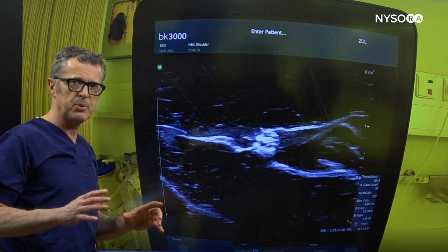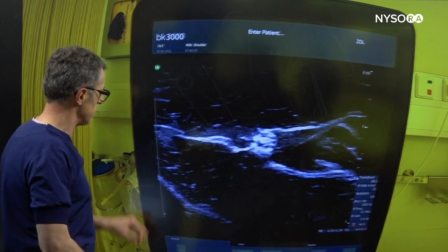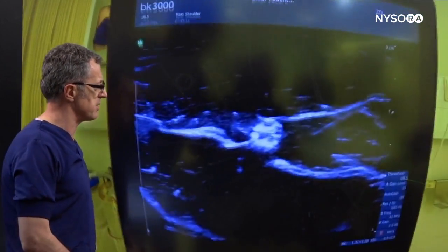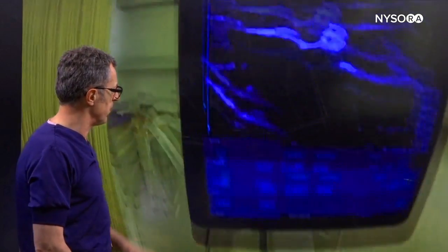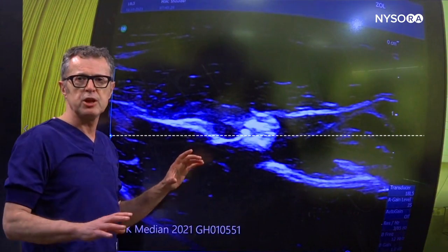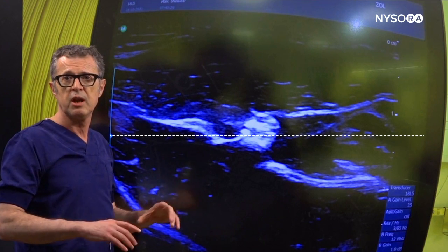What's still left to improve is to see whether adjusting the focal point gives us even more granularity or resolution. The focal point is currently below the level of our interest. Going to the controls of the machine, we find the button for the focal point and use the trackball to raise it up to the level of the nerve. That's about the best we can do for this purpose. These adjustments take literally 10 or 15 seconds and make a huge difference, particularly when the imaging is not that great.